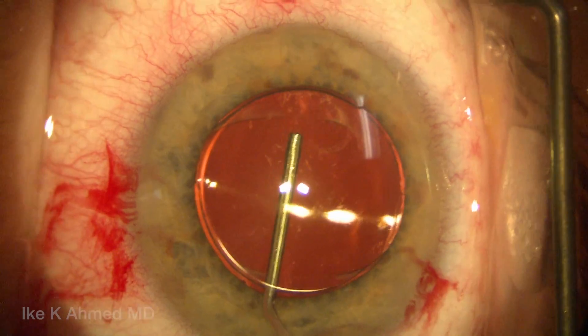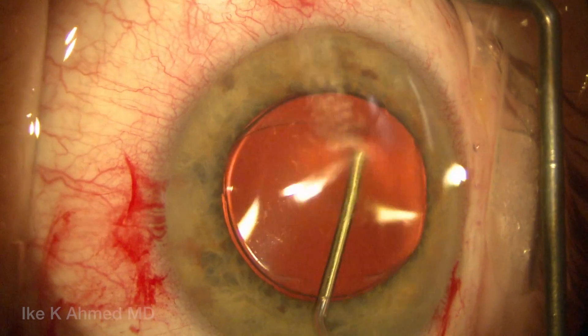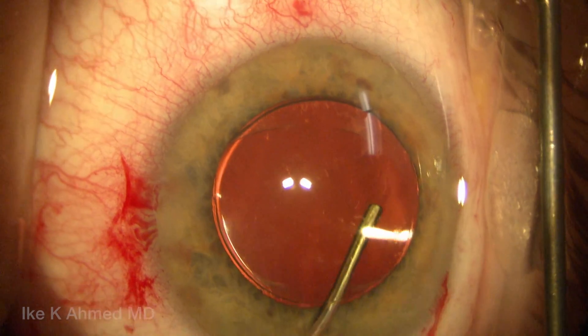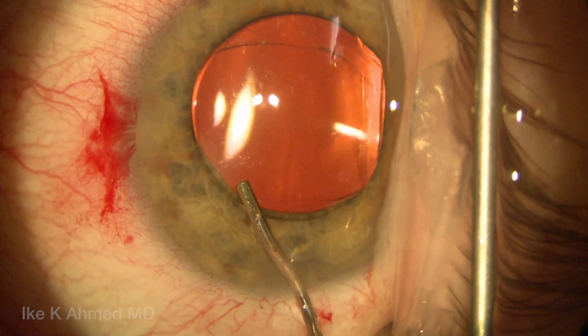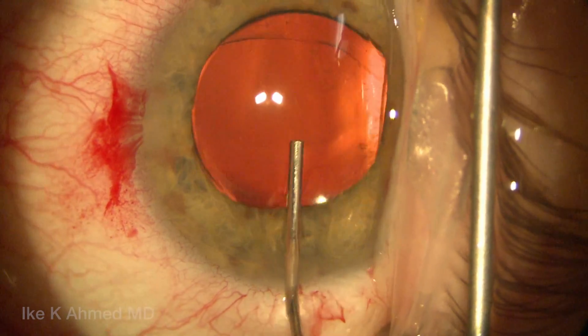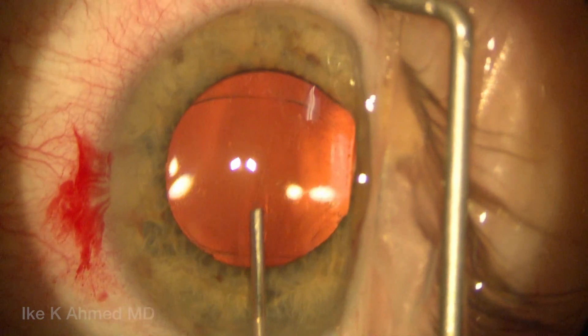We'll remove viscoelastic carefully using a 27-gauge cannula, irrigating and then aspirating manually to remove the viscoelastic material, which was cohesive in this case, from the capsular bag. We find cohesive to be the ideal agent to viscoexpand the capsular bag as well as easy to remove. It's important to ensure that the optic still remains in the reverse optic capture position.